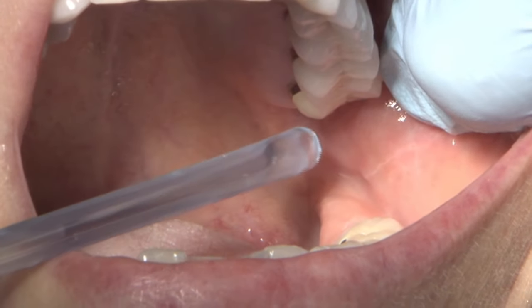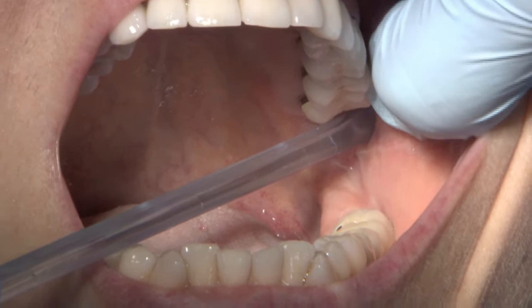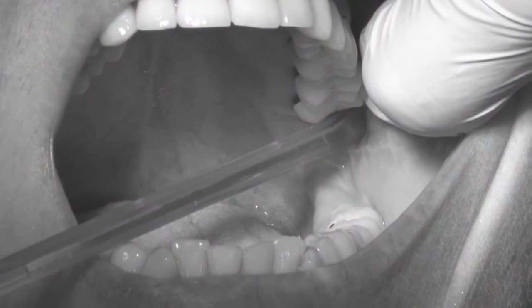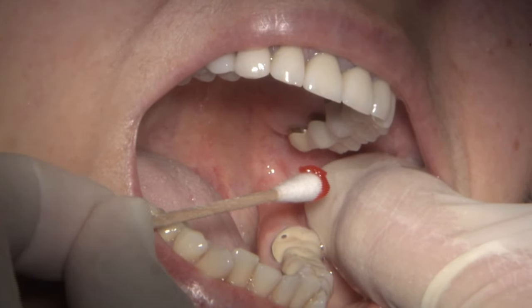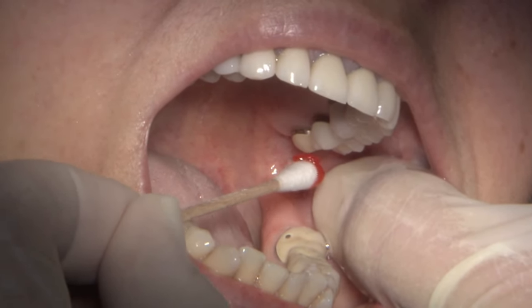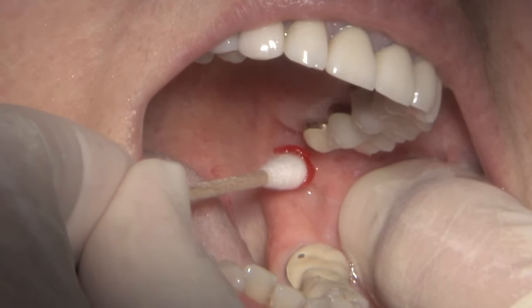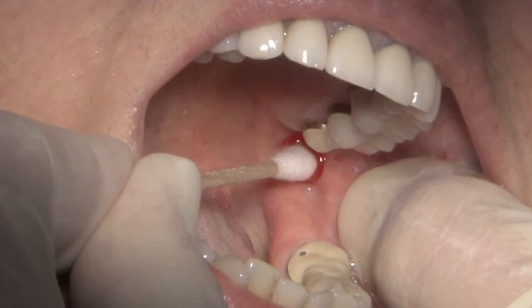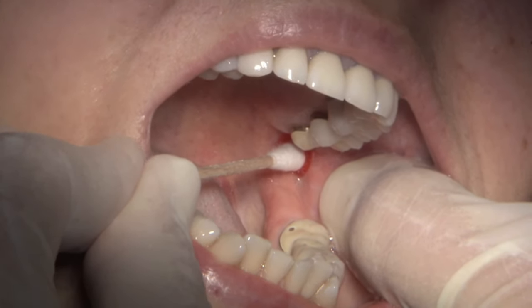Penetration will be there — open as wide as you can for me — with a slightly uphill inclination, tracking towards my finger that's palpating on the condyle. I'm going to start from over the bicuspids on the opposite side, go to the height of the mesolingual cusp of the first molar, then move distal to the second molar and place the topical there. That looks good — injection point.